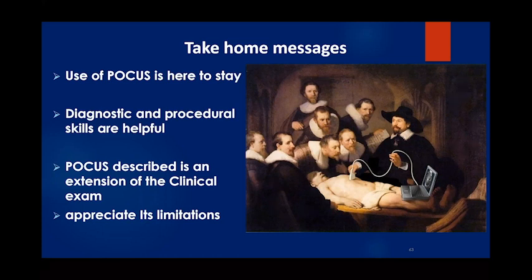How many point of care ultrasounds do you need? It depends on what application you have. For example, if you take a low stakes or low complexity application like lung ultrasound, you need to perform a minimum of 10 ultrasounds to be competent and signed off. And this should be 10 independent ultrasounds, and you should have a mentor for it. For echoes, for example, you need around 250 echoes to be competent in targeted neonatal echo. And this needs fellowship training, it needs echo lab training.